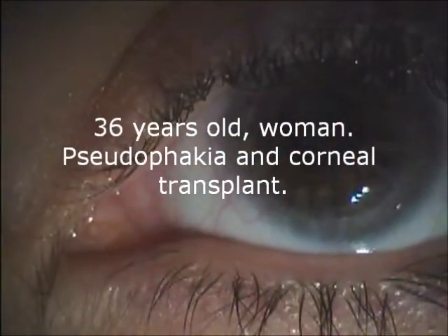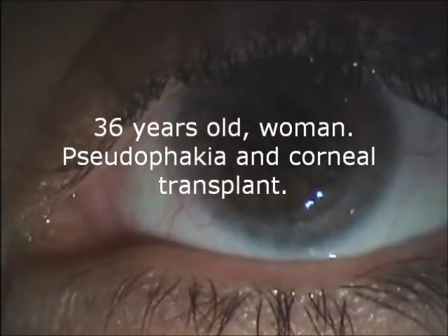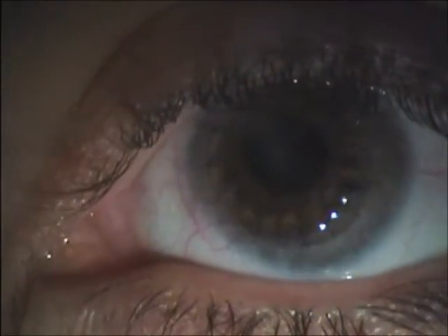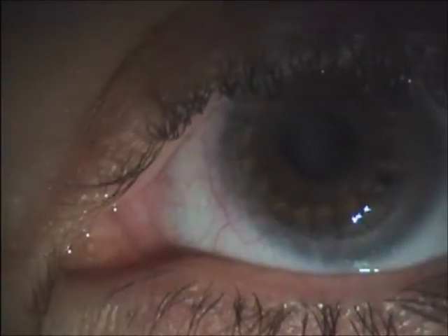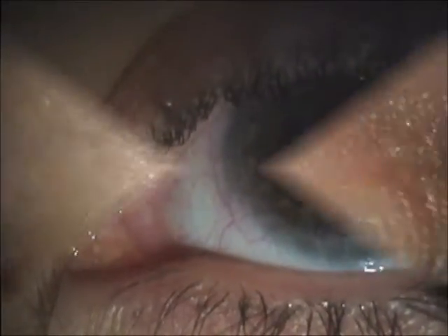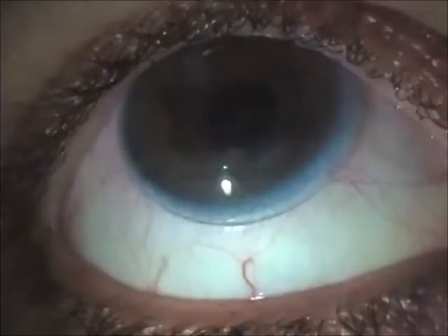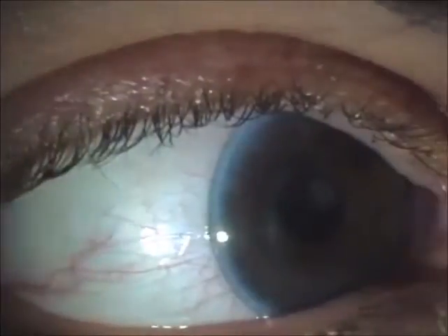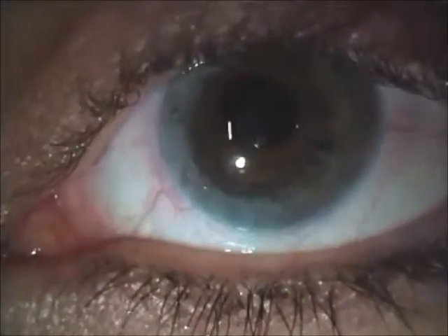In this first case, we present a 36-year-old woman with pseudophakia and corneal graft. We can see the perfect centering of the lens in the right eye, which allows a visual acuity of 0.1 logMAR.